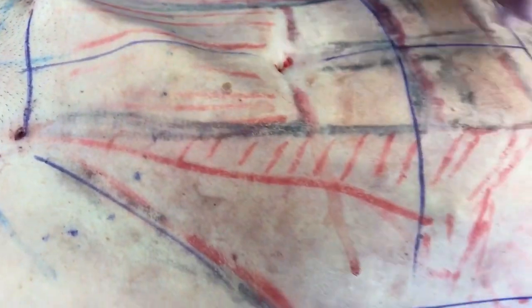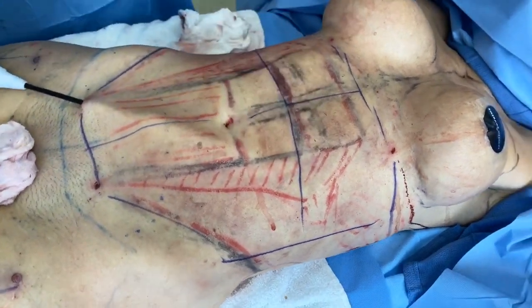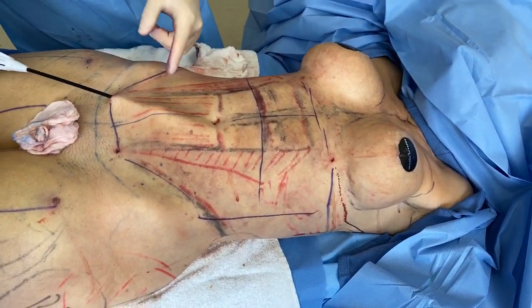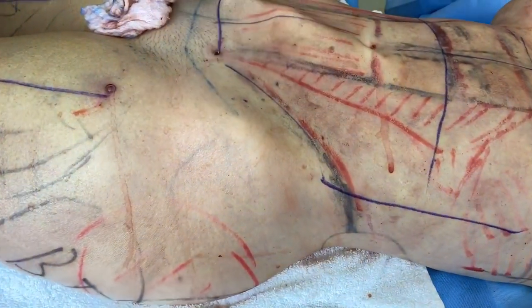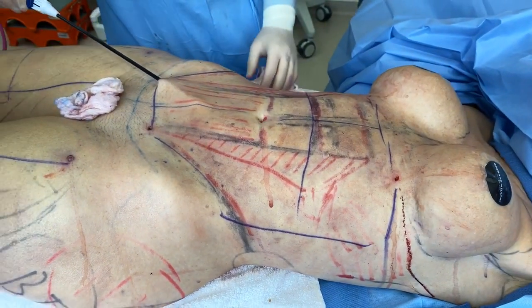It's literally shrink-wrapping inside — the little finger webs are underneath the skin grabbing the fibroseptal network, grabbing the fat, grabbing the skin and tightening it. You can even see smoke coming out. Look at her hip bones — look at how defined she is. So now we just need to tighten her.